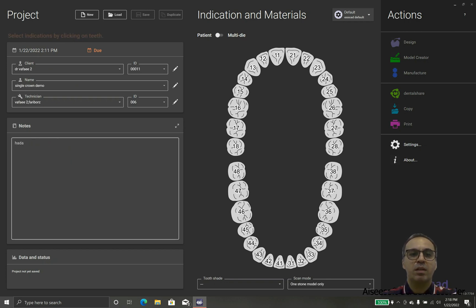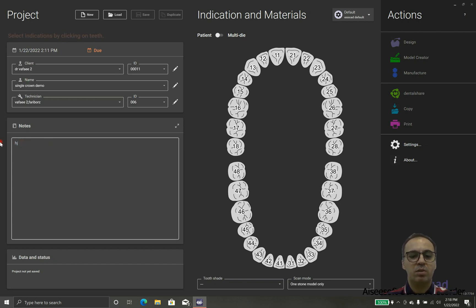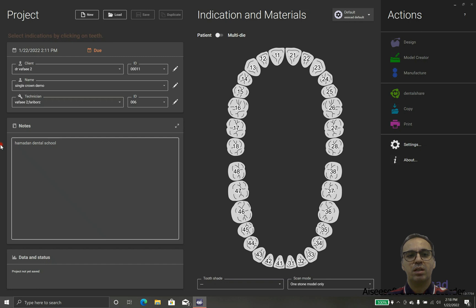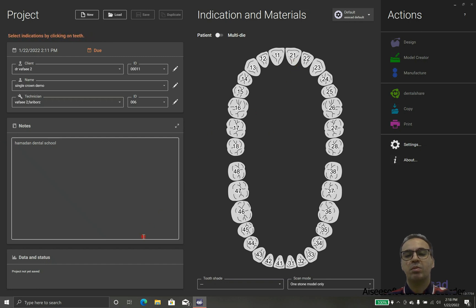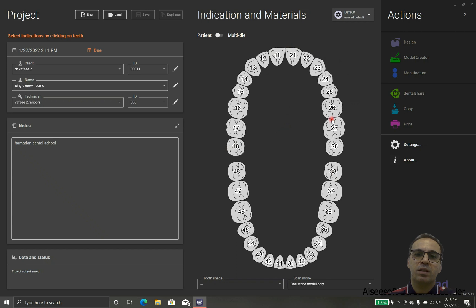So we add the client, we add the name and we add the technician, so we are ready to go. Sometimes we can add some notes because maybe in the future we forget what idea was behind the design of this special case.